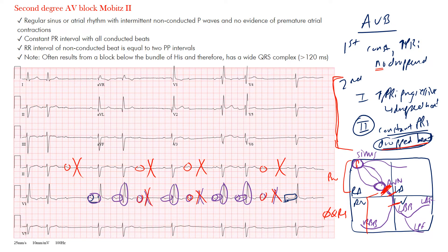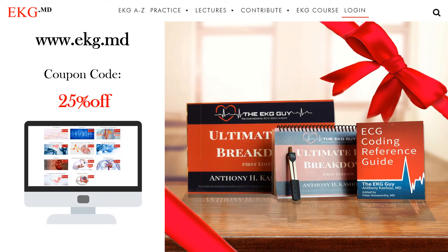These patients often get a pacemaker placed. The main thing to notice is the constant PR interval with all conducted beats. Hopefully you're able to differentiate between these blocks. In the next lecture, we'll look at complete or third degree heart block.